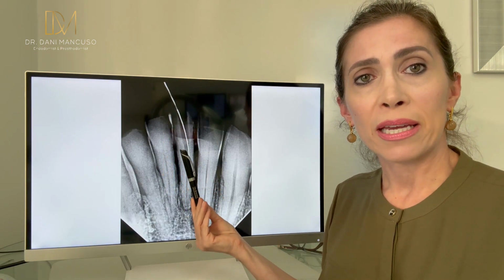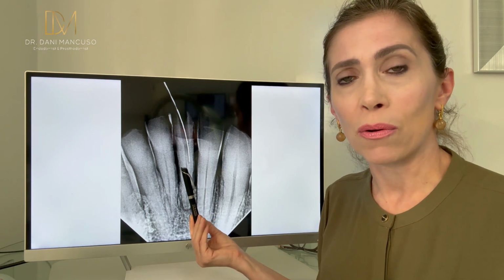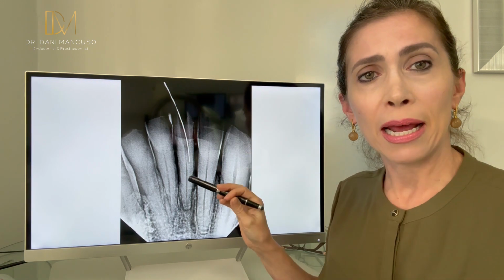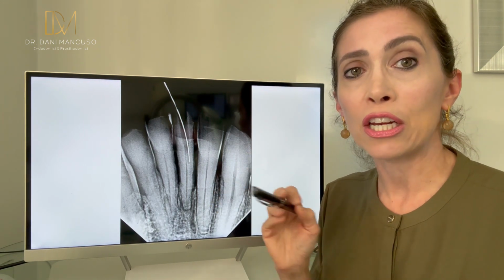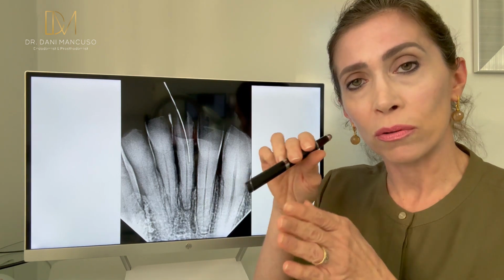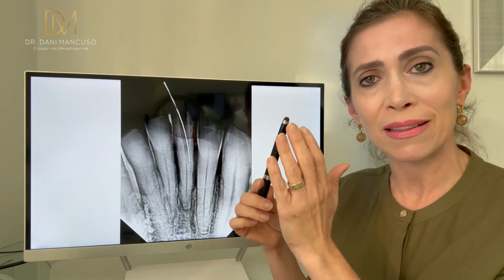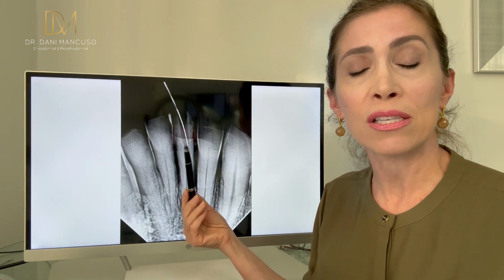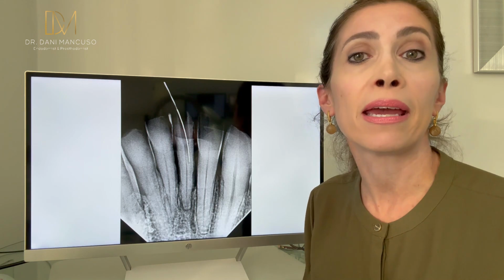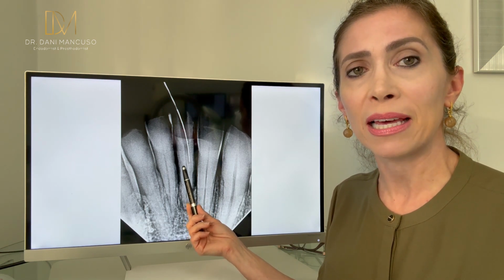But pay attention when I was going inside. That's my file now, because although I could see, I was going in the lingual canal, and the buccal canal was a bit more buccal, but the lingual canal, if you remember the CBCT, joins at the very end in the largest part of the canal. So they become one canal. And as I was going a little bit off, I decided not to pursue that and go in the largest canal first. That's what I was trying to do anyway, but I ended up going in the lingual more than the buccal. The buccal was slightly towards the front, and that is because this tooth was vertically tilted. So you need to consider that when you are drilling as well, not only mesial-distal, but you need to consider buccal-lingual, because otherwise the bur can play a trick and you end up again deviating that canal. So as soon as I noticed that I was going in the wrong one first, I immediately corrected that, and then I found the canal.